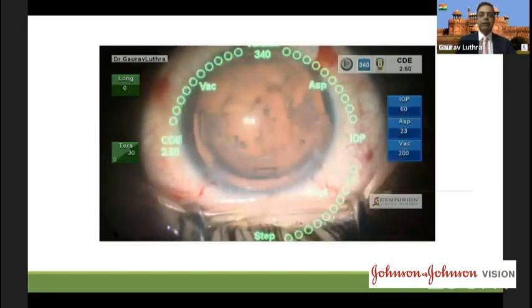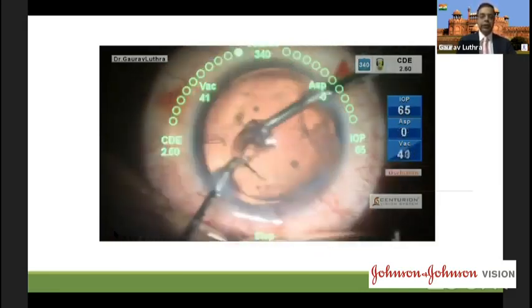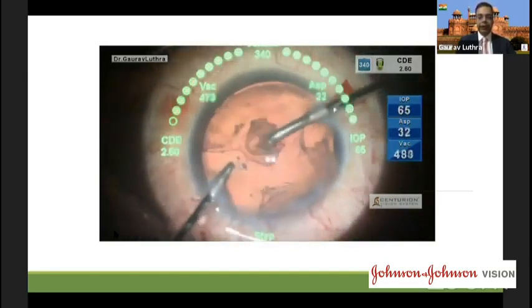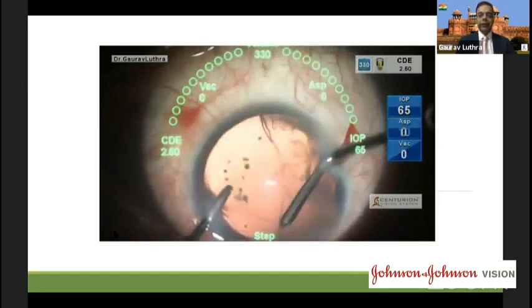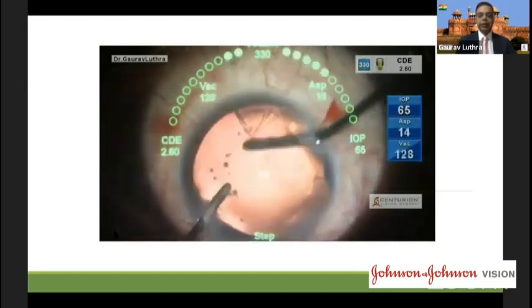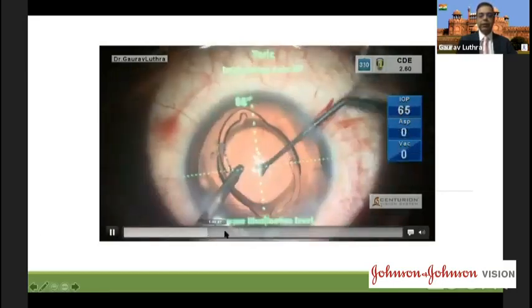So the single pass four throw pupilloplasty, which we will be utilizing here, and I'll be showing you the basic technique and the correct technique, and then some of the fallacies where you can go wrong, so that everybody gets a way of doing it very nicely at home, those of you who are still not doing it. So of course the cataract is out, and let me take you to the situation where we put in the lens now.